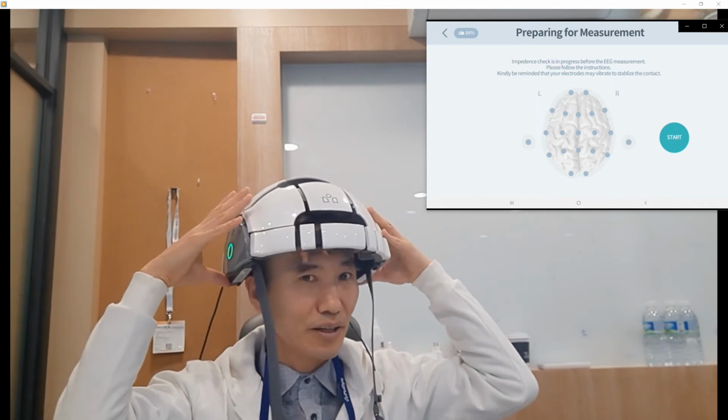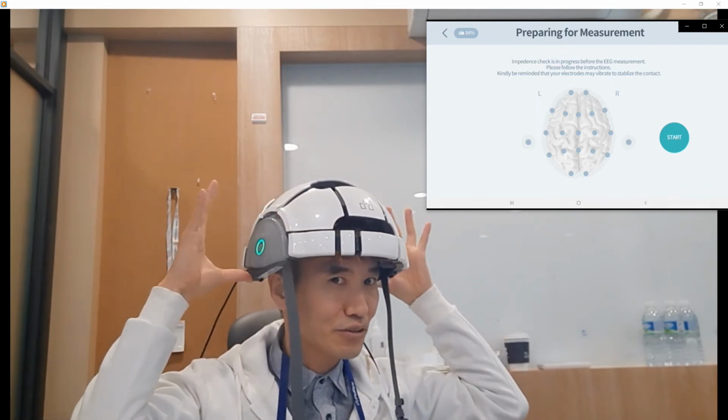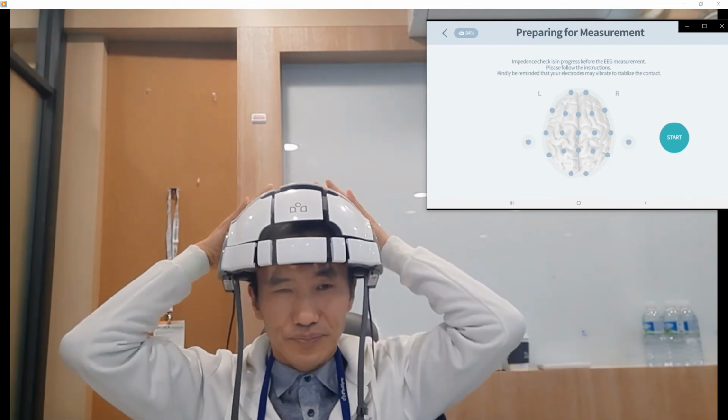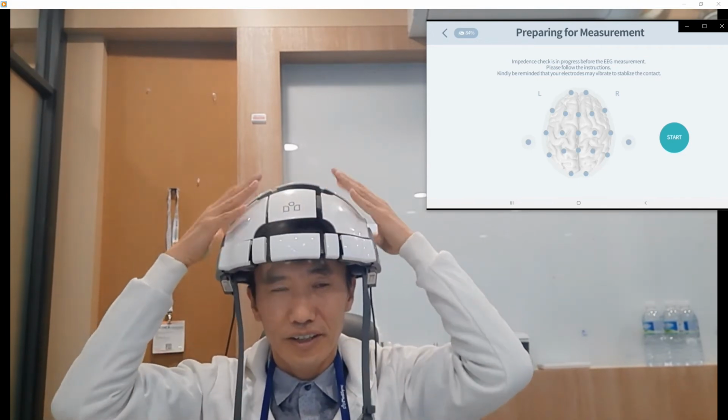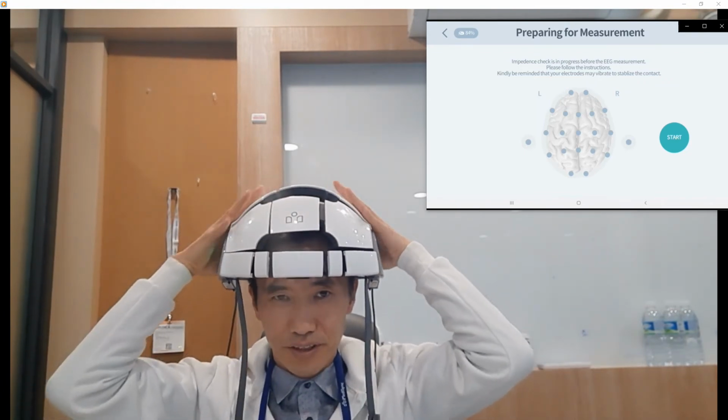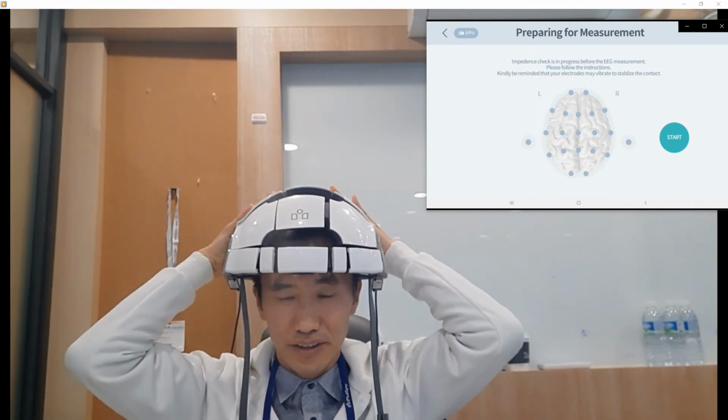For example, in the temporal area, we can gently push these two areas. Then the electrode can penetrate and make stable contact by gently pushing all the electrode areas like this.